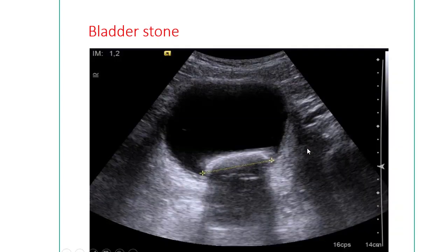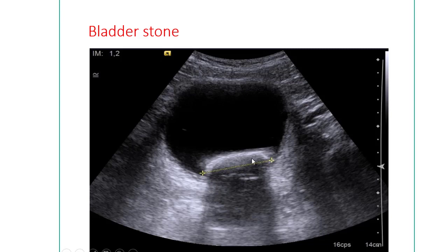This is a bladder stone — here is the bladder and this is the stone, which can easily be identified by ultrasonography. The bladder stone is mobile, so when the body is moved, the stone also moves within the bladder.